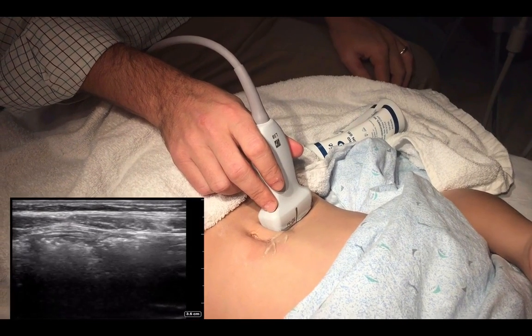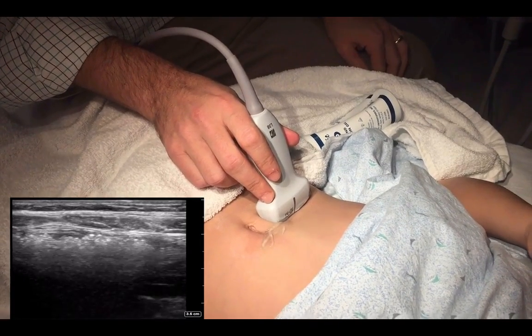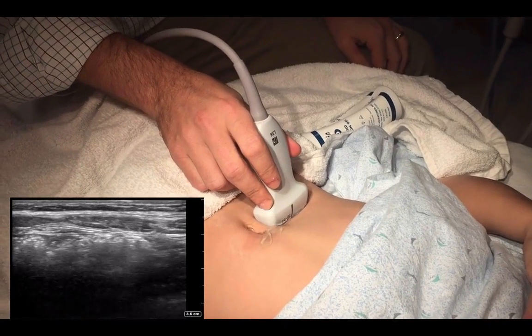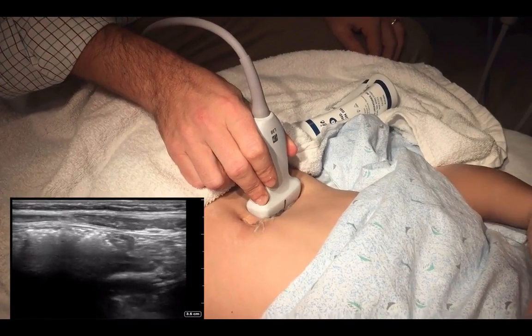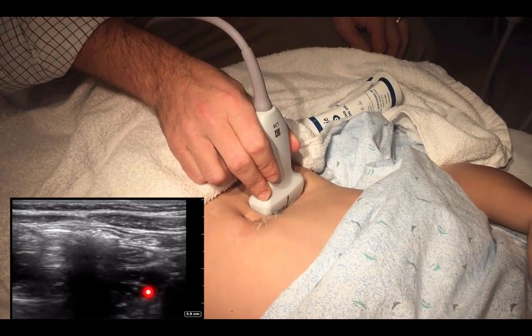As we're scanning, we also want to employ some graded compression. This involves some gentle pressure on the probe to get rid of some of our overlying small bowel structures, and just enough so that we can see the psoas muscle come into view as it is in the bottom right of the screen.